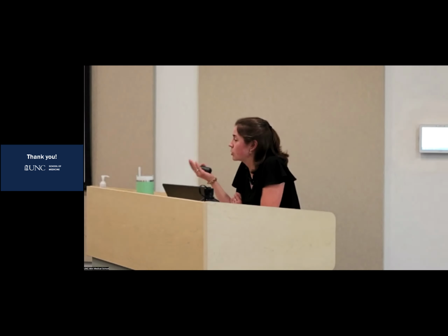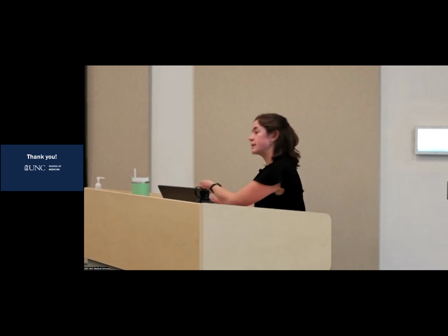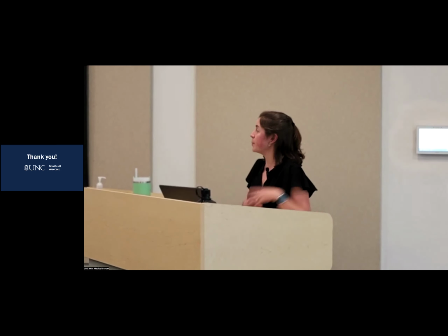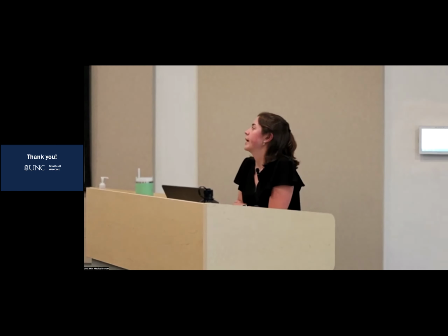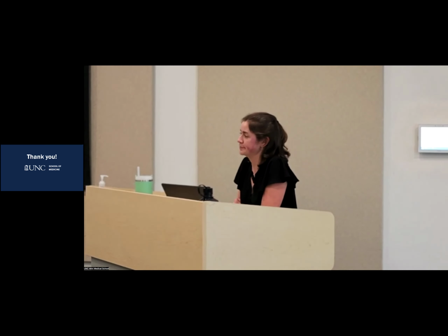Then like I mentioned earlier with the portability, maybe you aren't able to get the patient all the way to the scanner. Ultrasound right at the bedside is going to be a better thing to do, not considering cost, but just thinking about the mobility of your patient, for example. So we are essentially weighing all of those different options, and we want to just get the best picture that we need for the scenario. Sometimes we need a really nice, pretty picture in order to visualize something, so we're going to get the more fancy MRI. Or if the patient is pregnant, for example, we're going to opt for the MRI because of the radiation. That's a good question.